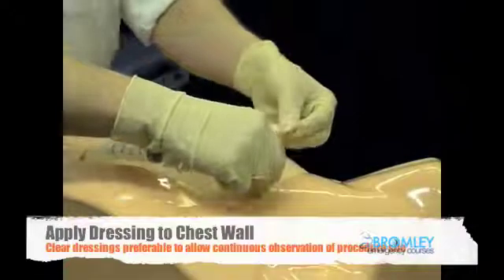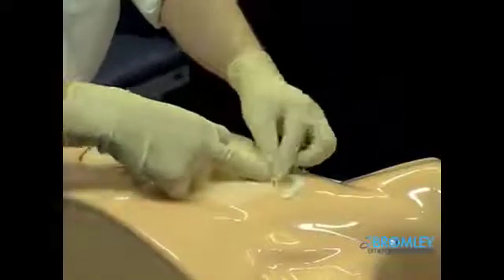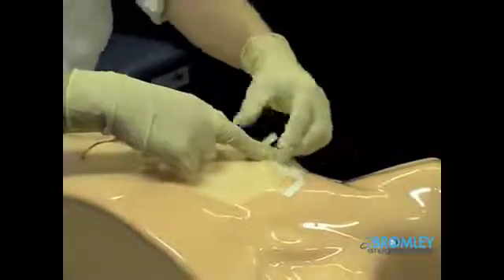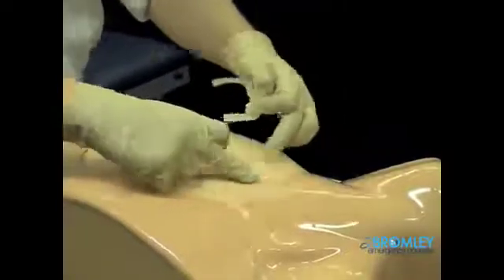Having removed as much air as possible, remove the syringe and apply a clear dressing. Reassess the patient clinically and offer analgesia where appropriate. After a period of time, the patient will now require a further X-ray to reassess re-expansion.